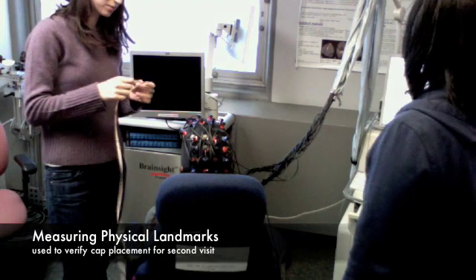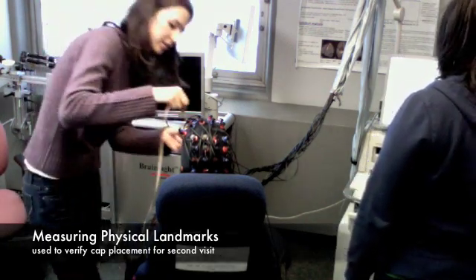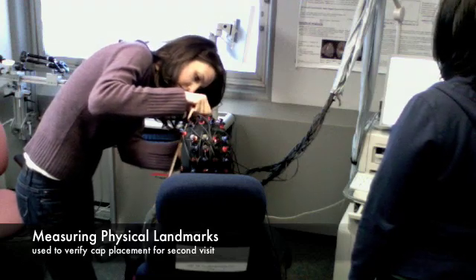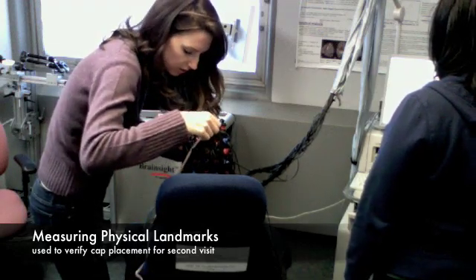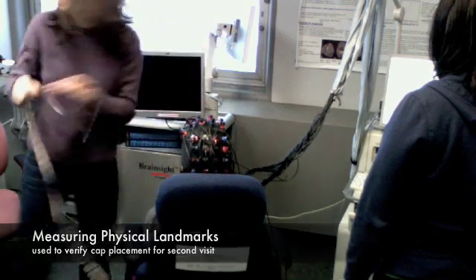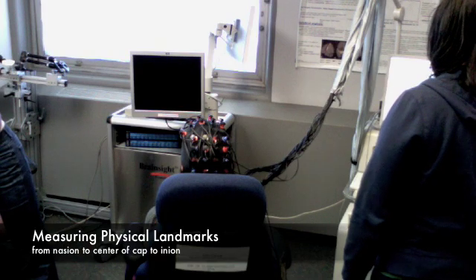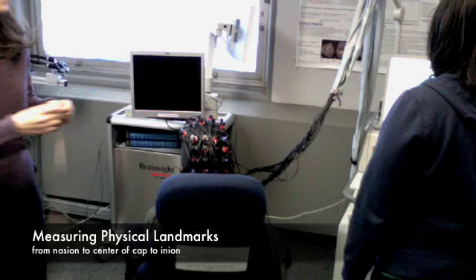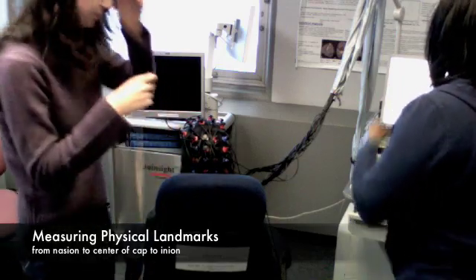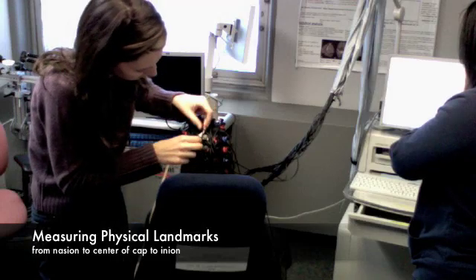All right, now I'm just going to be making some measurements so that we can, next time you come in, place everything more accurately.